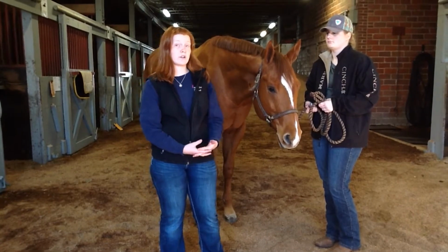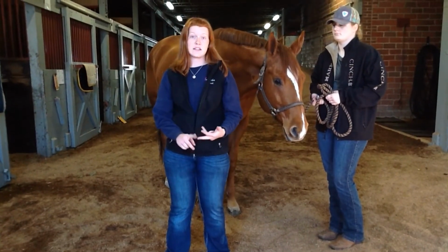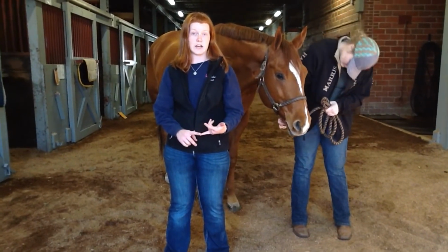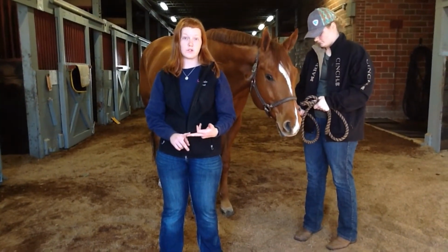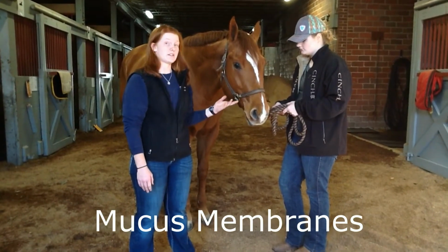Some things that you're going to need whenever you are taking your vital signs are Vaseline and a thermometer. You can either have a digital or a mercury or a non-mercury, as those are now a thing. You need a stethoscope, or you can use your ear. The first thing I'm going to demonstrate to you is mucous membranes.